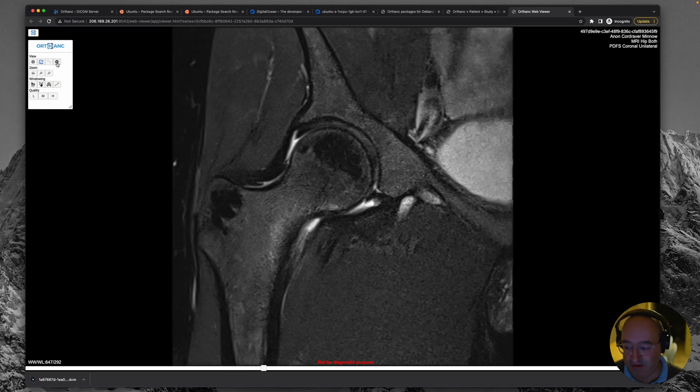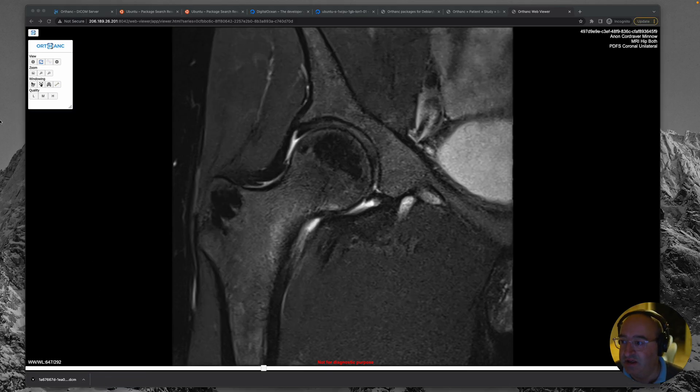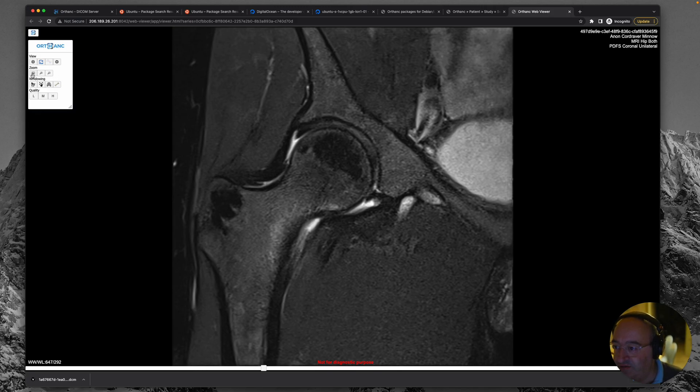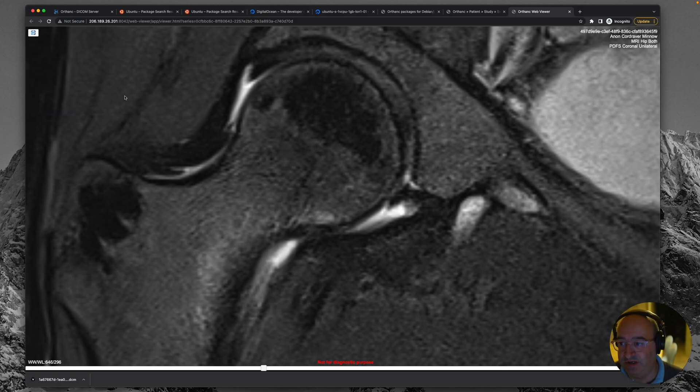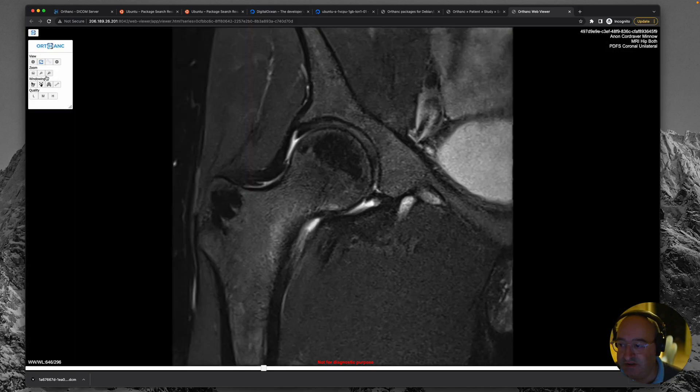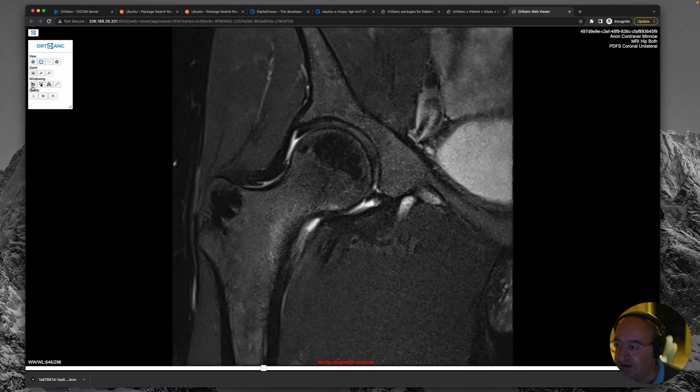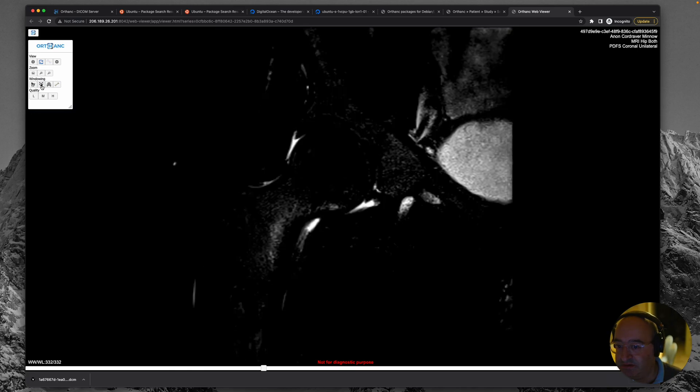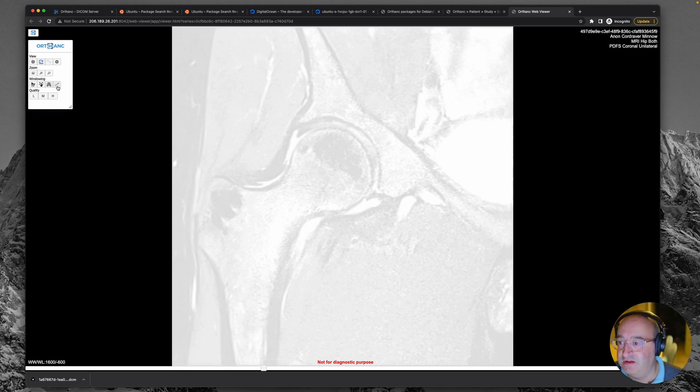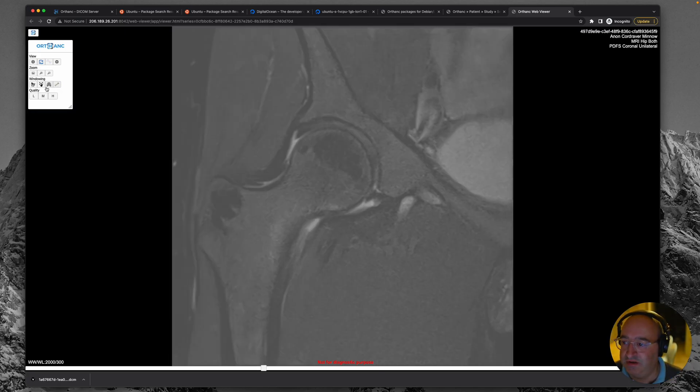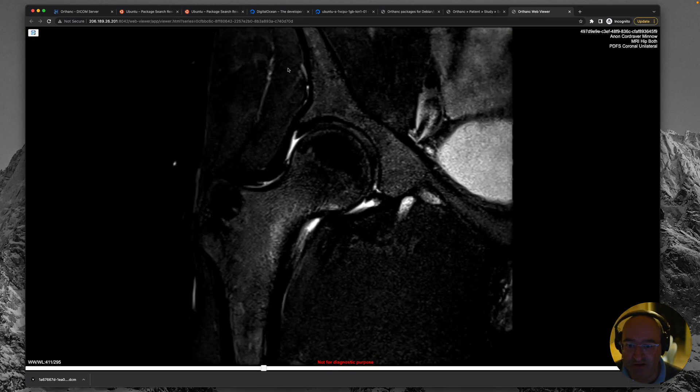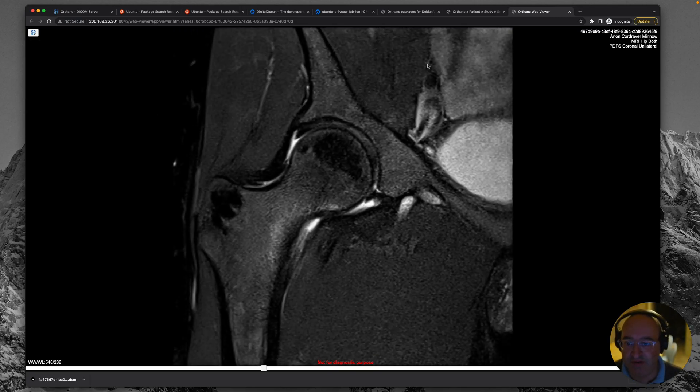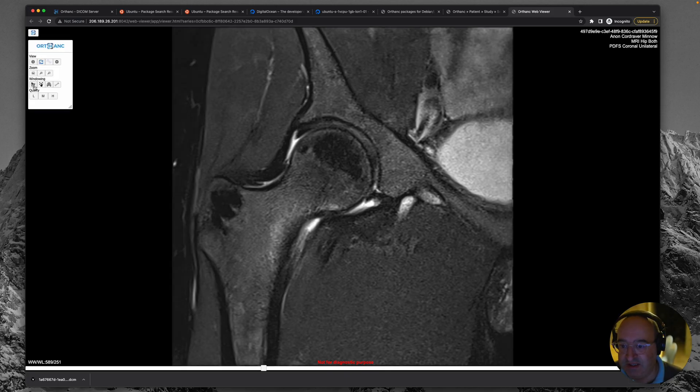And I've got a little drop down here. Oh, that was download. So it's downloaded the DICOM file here. Yeah. And then we have some zoom options. That's gone really big. Small. And I guess that fills the window. And then windowing. Default. Don't know what that one does. Oh, they're different windows. So lung. Bone. So these are more for CT. And then this one. I don't know what that one's trying to do. It wasn't that useful.